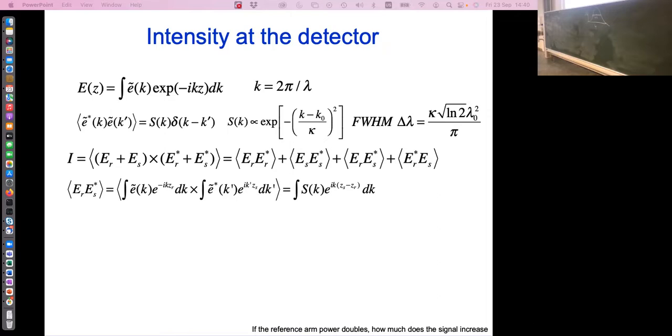And now if you look at this, does somebody recognize this expression? Sorry? Well, you're getting close. It's not a delta function, but what if I do this? F of omega is the integral of f of t e to the i omega t dt. What do you call this? Yeah, this is a Fourier transform, right? If you look at this one, what does it look like?